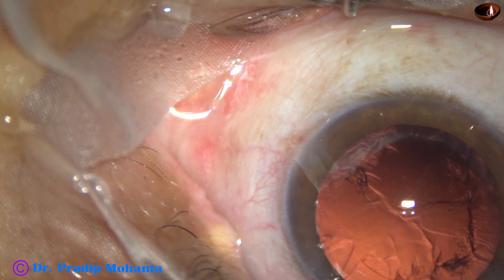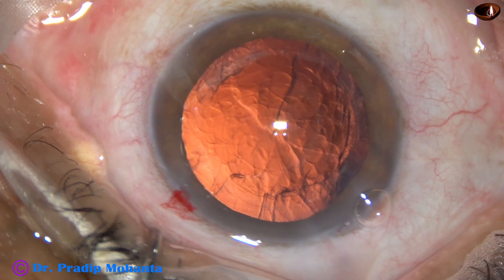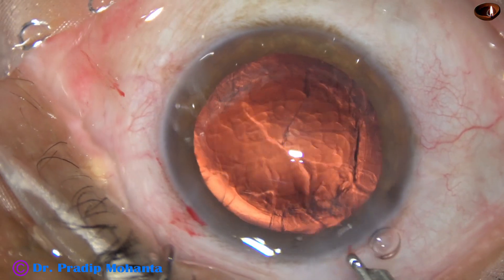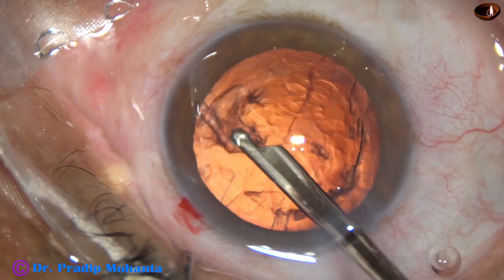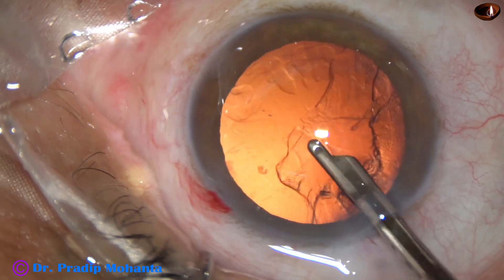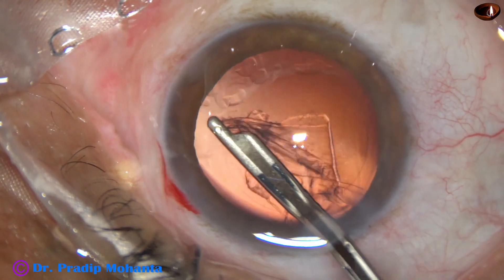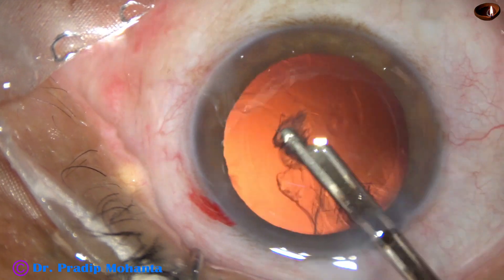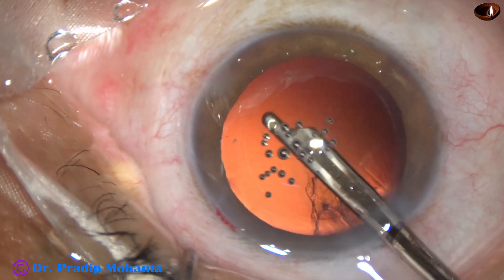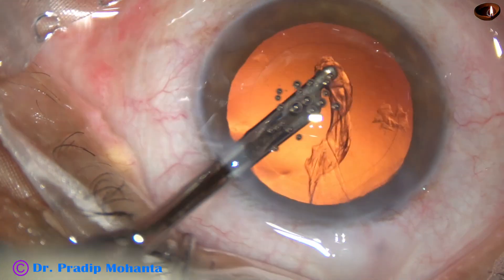Now is the time to remove the cortex. Some visco is used to maintain the anterior chamber. Then the 23-gauge Simcoe cannula is used to remove the cortex. We have only one side port and cannot use bimanual irrigation-aspiration. However, we can use coaxial IA and go through the side port to remove the sub-incisional cortex.